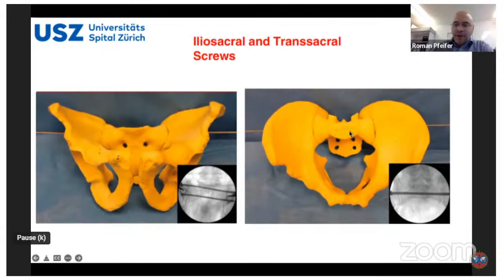In this view, you need to prove radiologically that S1 is over the S2 position. If you place your screw or guide wire in the middle of the bone, as shown here, you can exclude or avoid any damage in the front to the vessels or important nervous structures, and similarly also in the back, which is not so easy to see in this view.